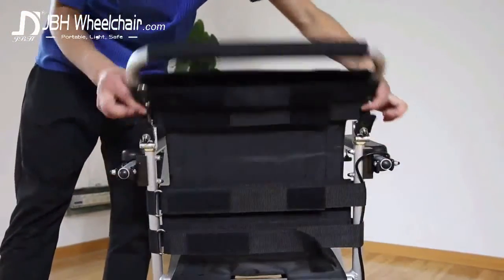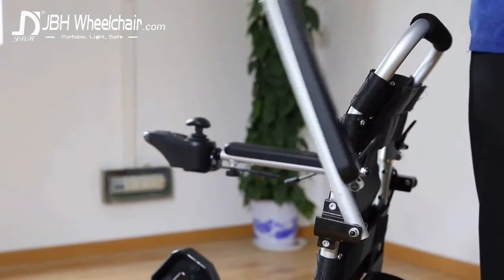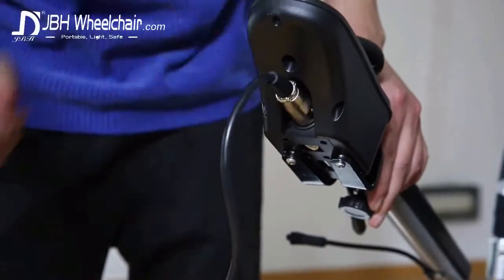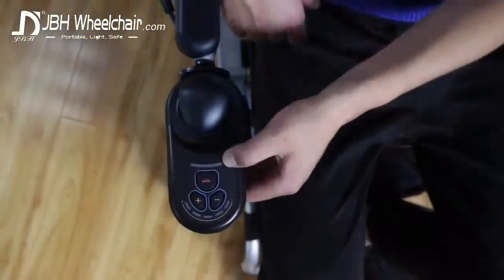The backrest and armrests, made in lightweight aluminum just like the frame, can be folded. Simply plug in the 360-degree joystick controller and you are ready to go.